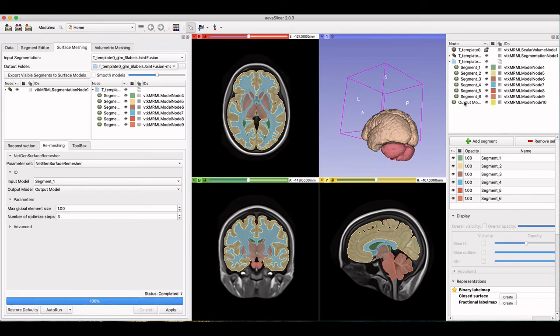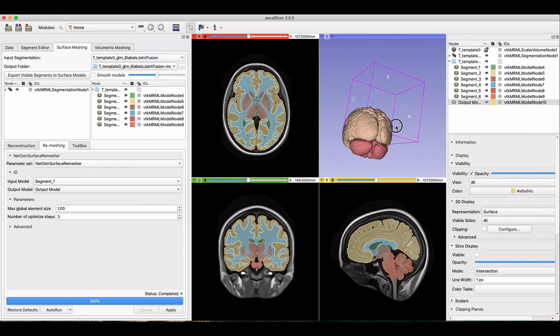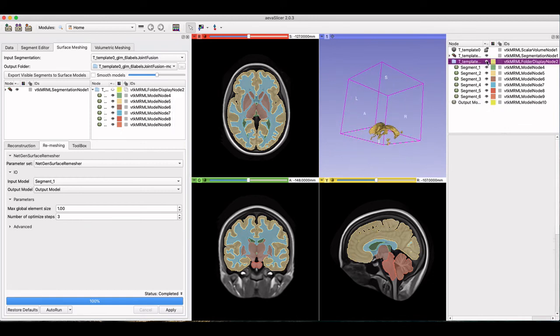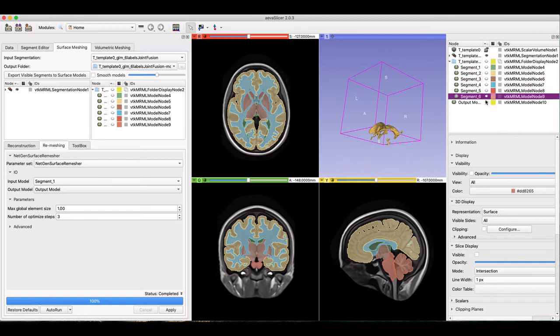There are many features in the toolbox to adjust the output mesh. Taubin smoothing is a feature unique to AvaSlicer that is useful to smooth the mesh but preserve its volume.